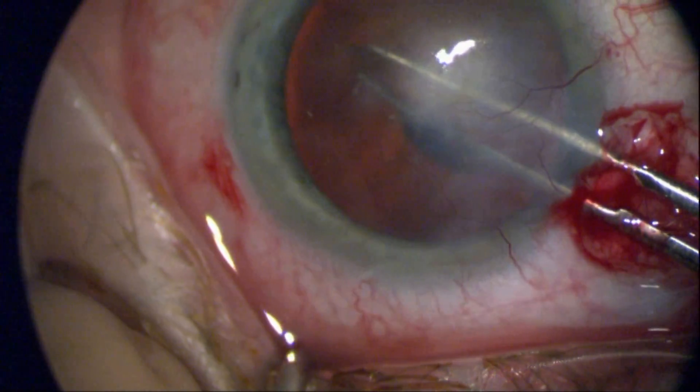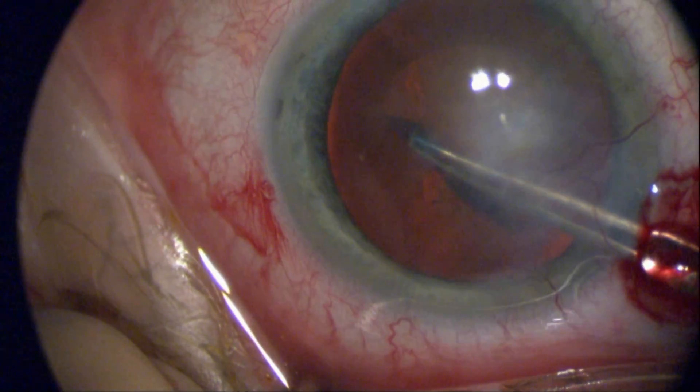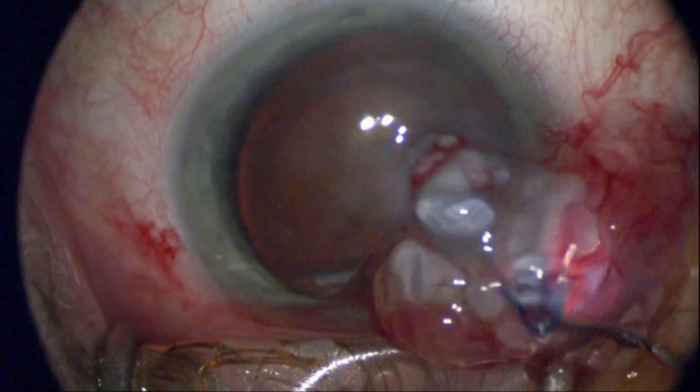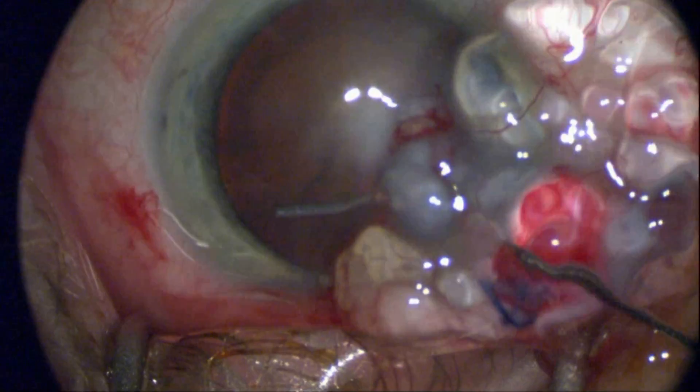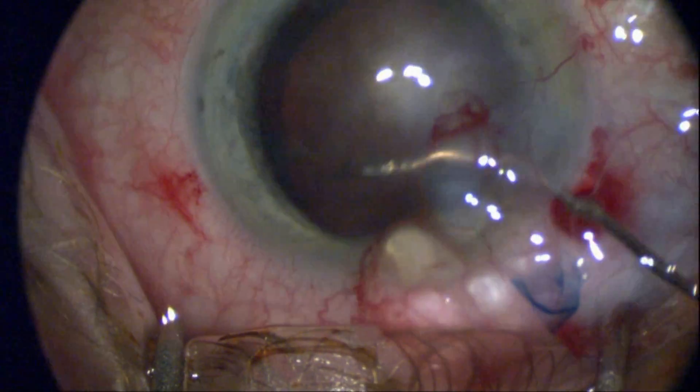I've stained the anterior capsule with Vision Blue trypan blue, which allows me to better visualize the tearing through the corneal scar. I'm going to be fairly aggressive here with hydrodissection to bring the lens forward.